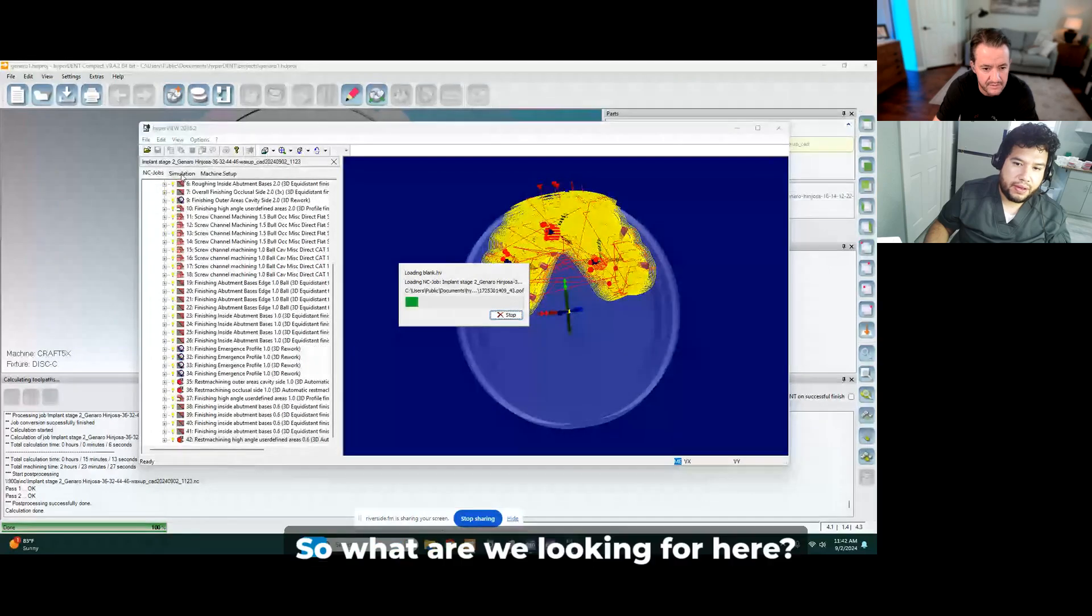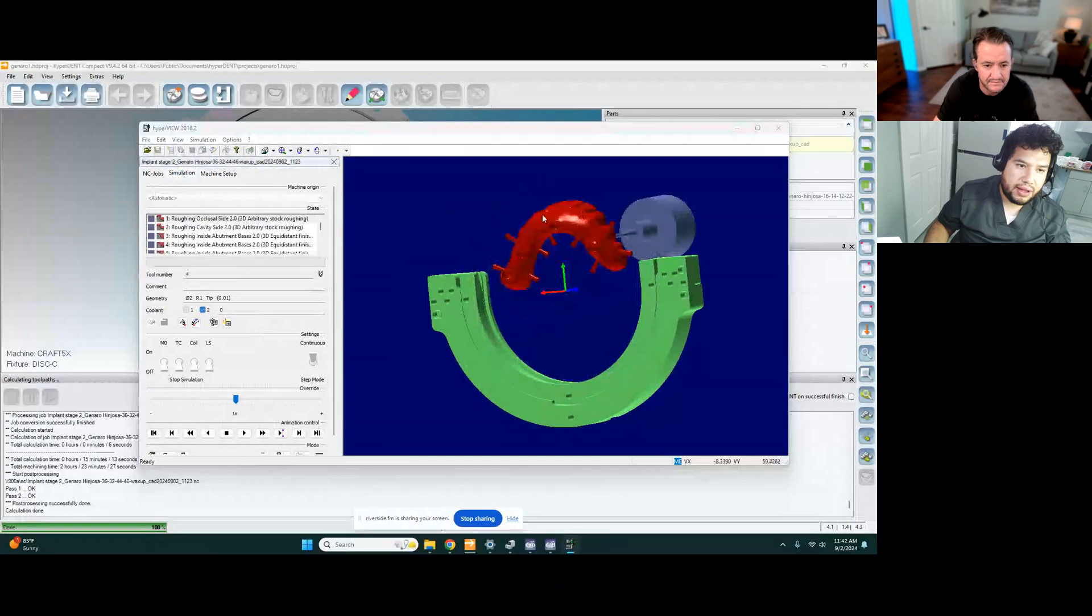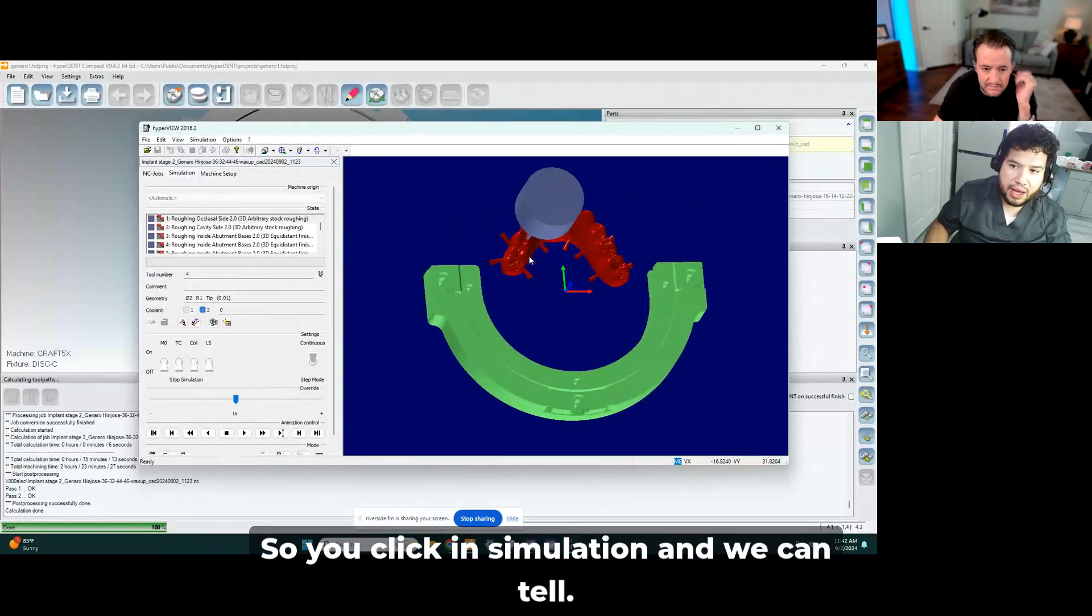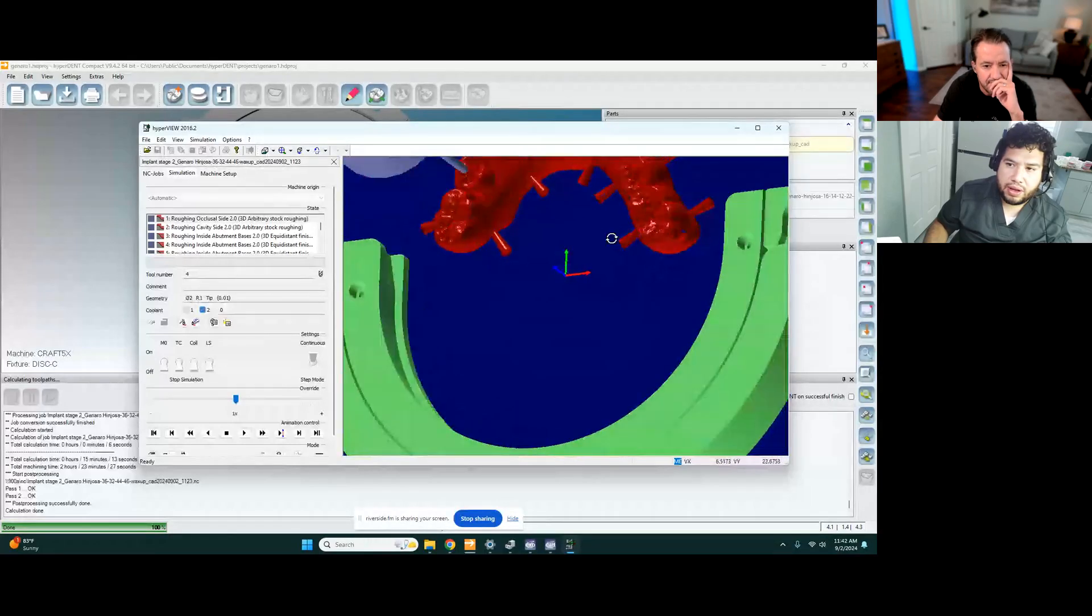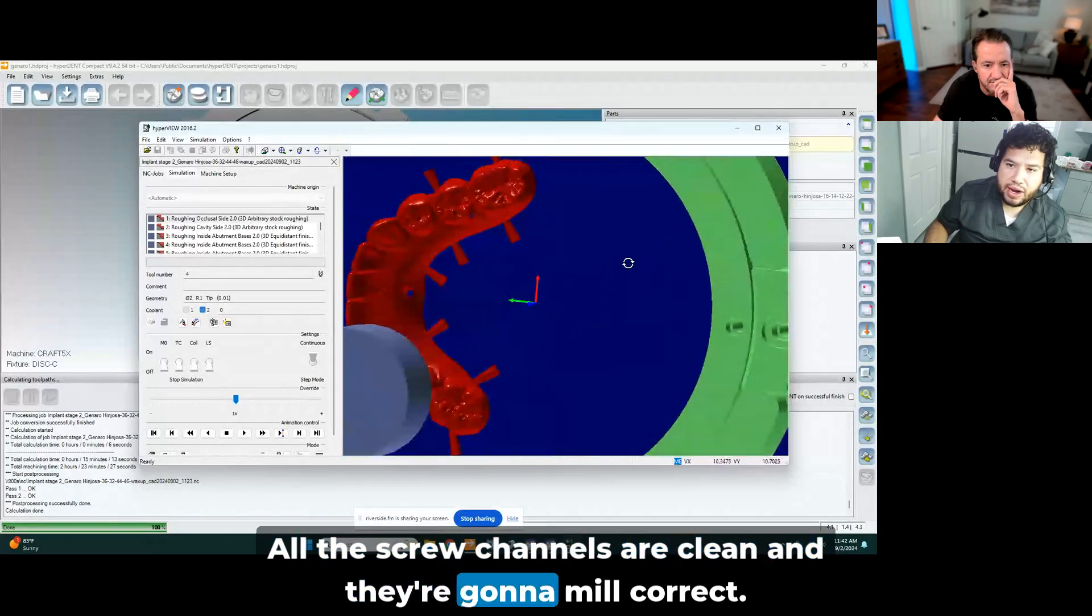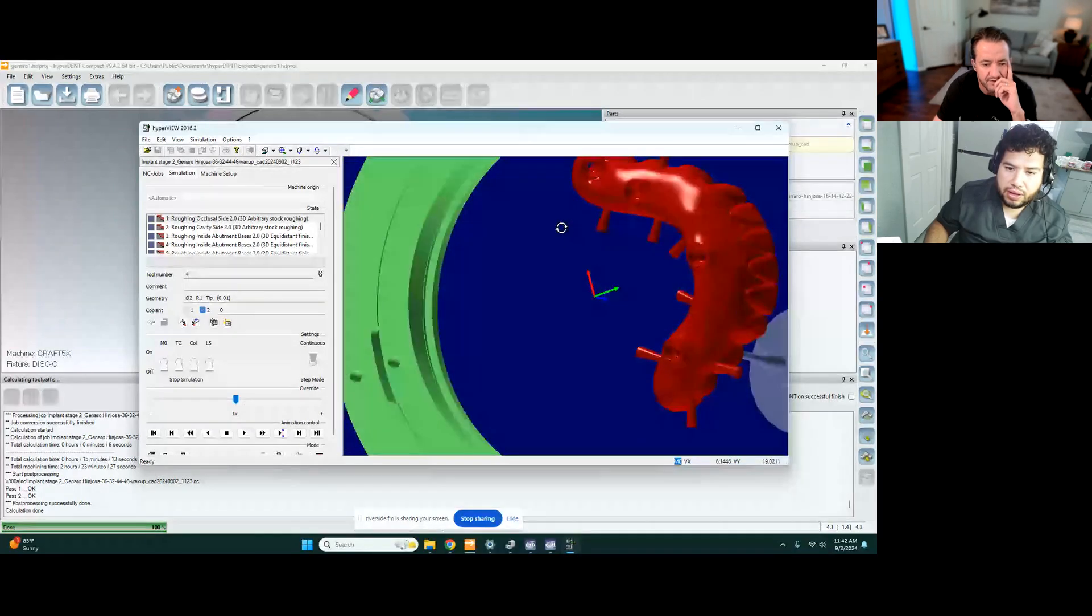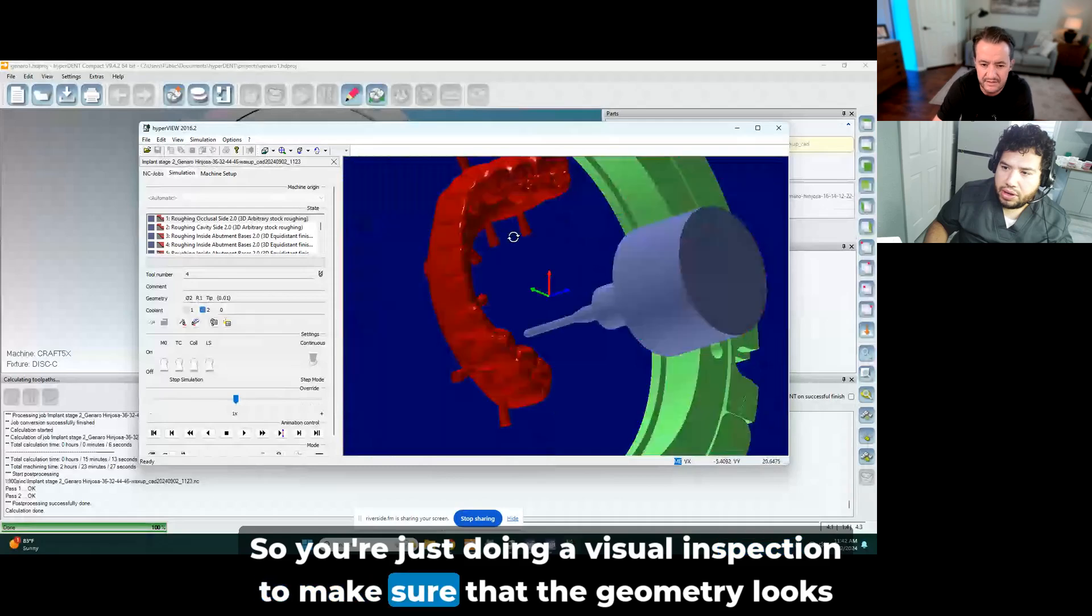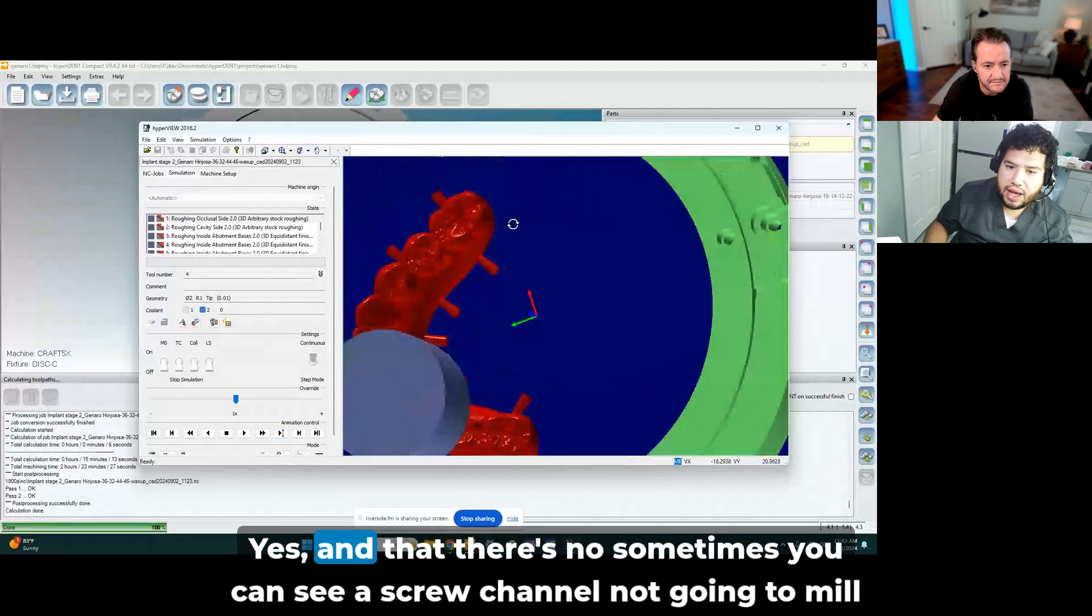So what are we looking for here? We're gonna make sure everything's milling correct. So you click in simulation. And we can tell all the screw channels are clean and they're gonna mill correct. So you're just doing a visual inspection to make sure that the geometry looks clean. Yes.